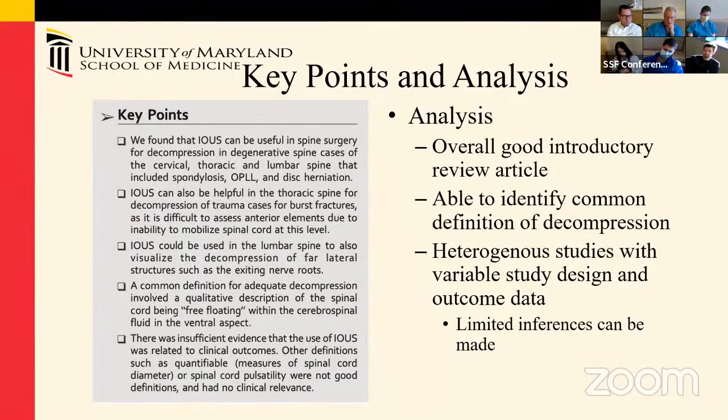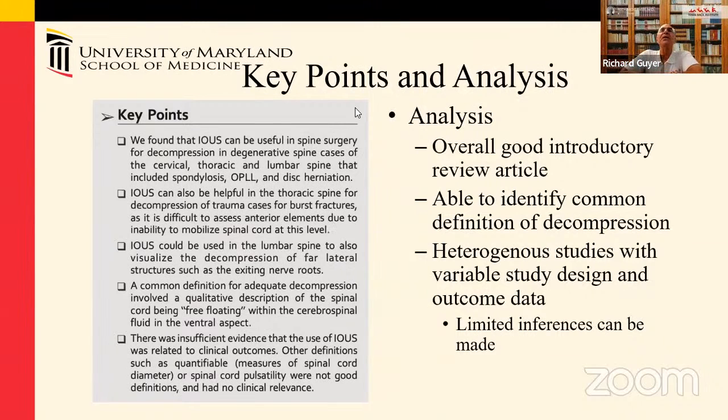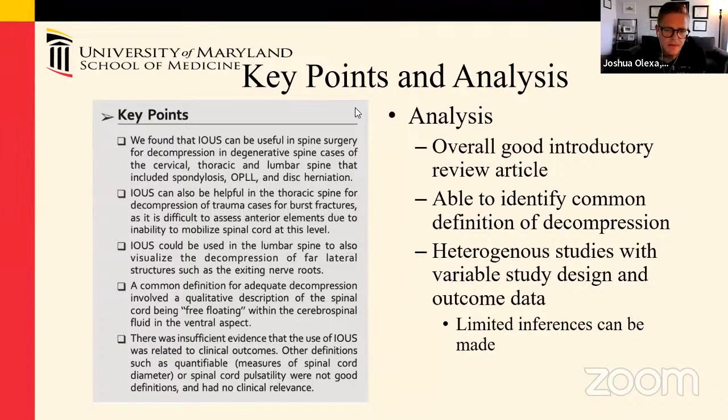Sure. Josh, I have a question. How large is the tip that actually does the measuring? Yeah, that's a good question. So if you've ever seen the different probes, do you want to answer this one, Dr. Crandall, or do you want me to? Yeah, I can. I wish that I had pictures of all the different probes. That would have been a good thing to give as an example. So there are different sized probes, and they're typically much smaller than the ones that the anesthesiologist uses to put in lines. The two probes that are most commonly used.